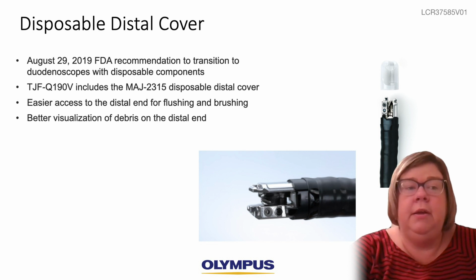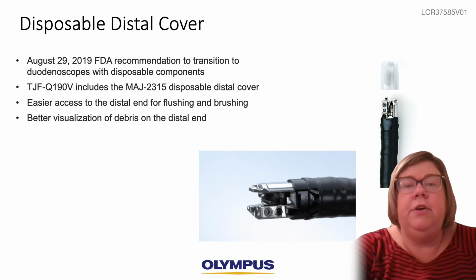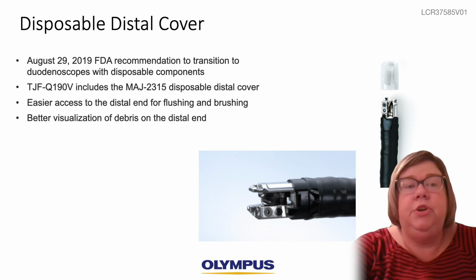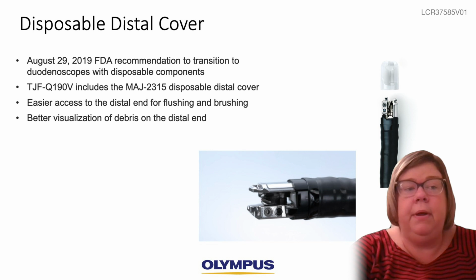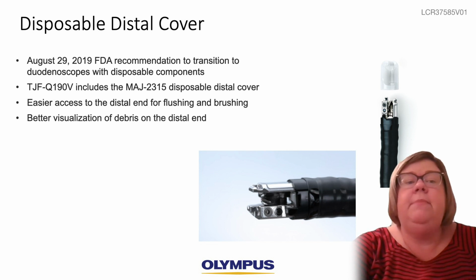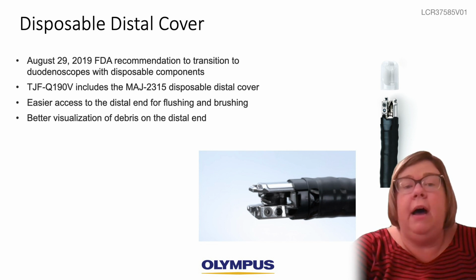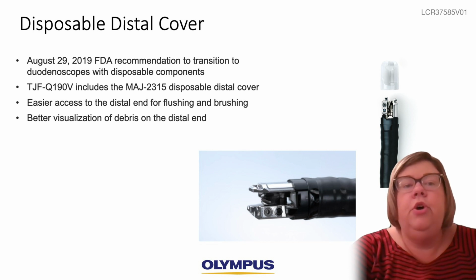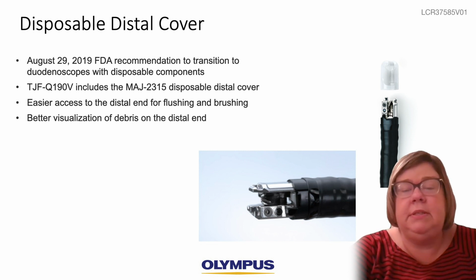visualization of debris. Personally, in the field, I have witnessed this with facilities that are transitioning into this new TJF Q190V in that they have absolutely had better visualization of the distal tip once they have removed the cap. We have also received images and videos from accounts who have removed the cover and found stones and sludge wedged behind the elevator that they would not have been able to see in previous generation scopes.